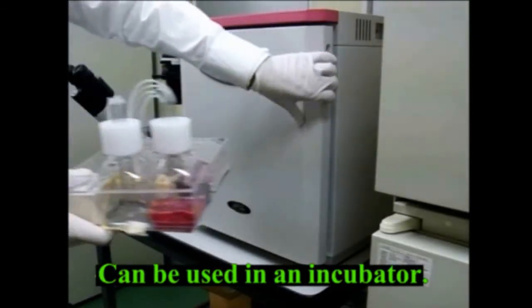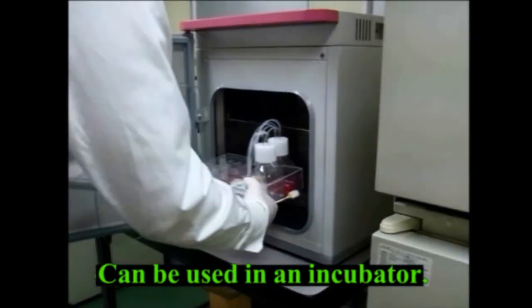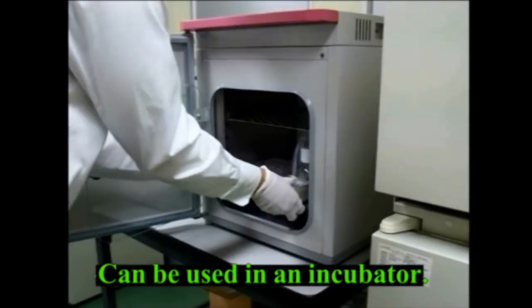The system can be placed in an incubator without any wiring and can operate continuously for up to 7 days with batteries.